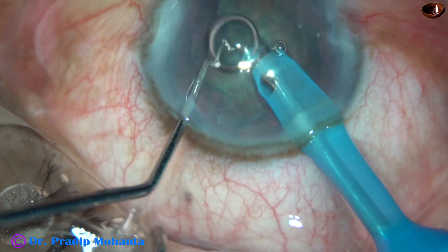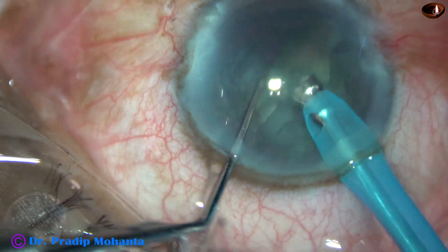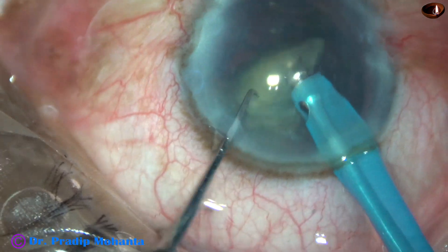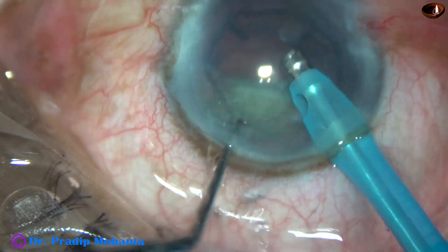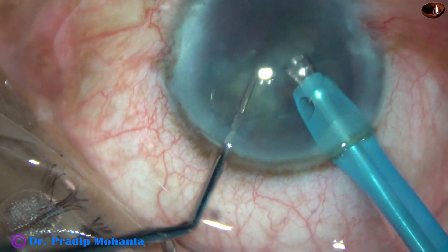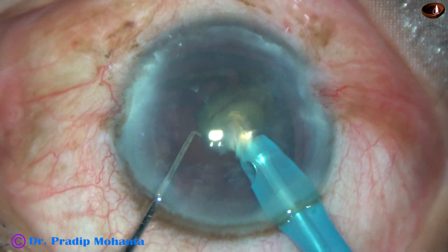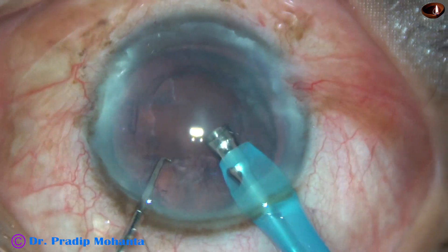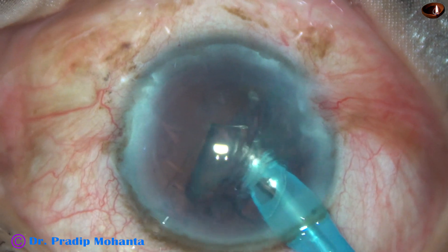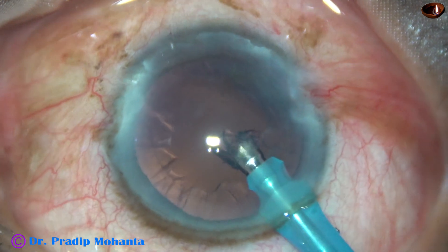And it is done — one more chop. This free nuclear fragment is emulsified. The second fragment is emulsified with ultrasonic energy of about 60%, flow rate being 45, and vacuum is 450 mmHg. This is the last nuclear piece — it is emulsified. And this is the epinucleus. So nucleus and epinucleus have come out.